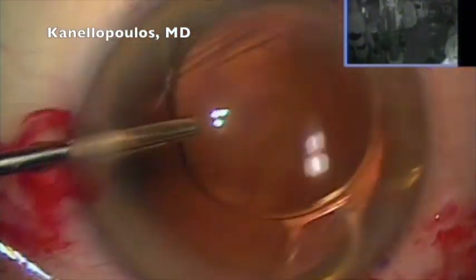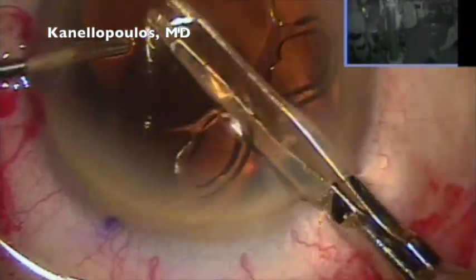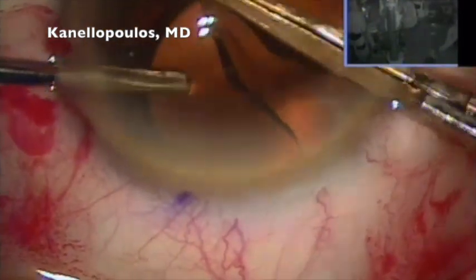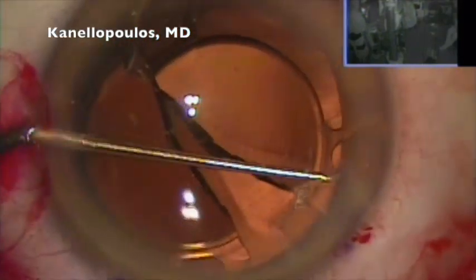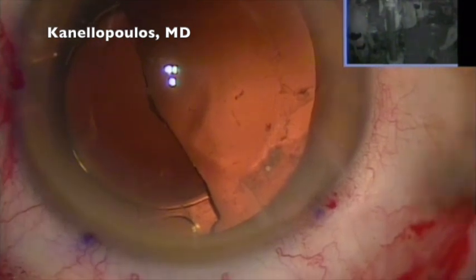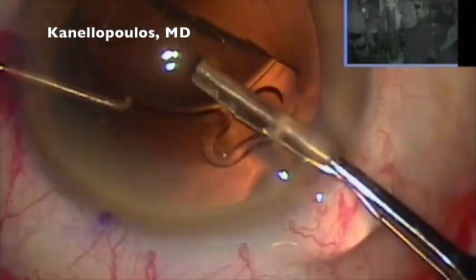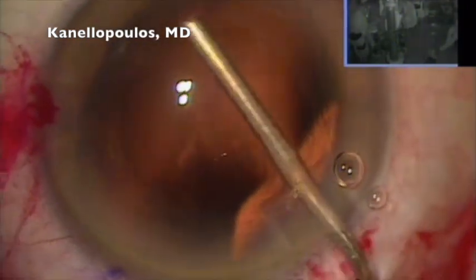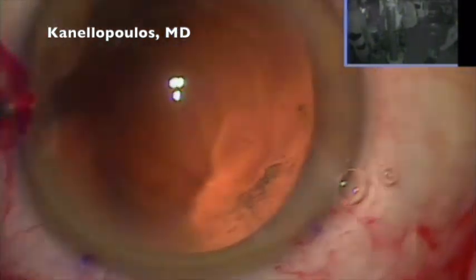I'm adding in more viscoelastic. I'm grabbing the lens and bisecting it with scissors in half, and we will pull each half out through our 2.75 millimeter incision, which is my go-to incision for my axial toric IOL, which, as we noted previously, I have calculated to achieve a half diopter with the rule. This is the non-dominant eye. According to our assessment, I'm filling in the capsule bag.